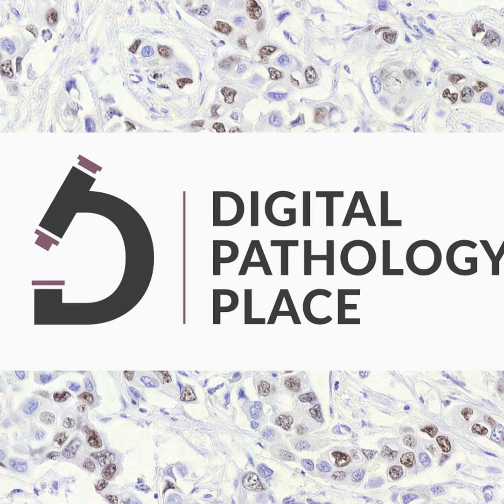And this was calculated with the assistance of AI, which I'm very grateful for, because then you get much more accurate results than when you estimate the H-score and all these other numeric scores visually, not really counting the cells, even though the score is based on the number or percentage of cells. They used AI for the H-score, and they had these prostate cancer areas with similar H-score, which they then unified in segmentation on ex vivo CT.